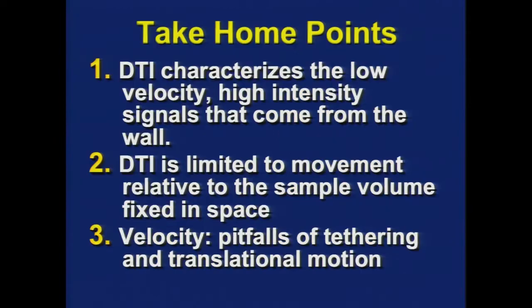So the take-home points here are that Doppler tissue imaging characterizes the low velocity, high intensity signals that come from the wall. Doppler tissue imaging is limited to movement relative to the sample volume, which is fixed in space.